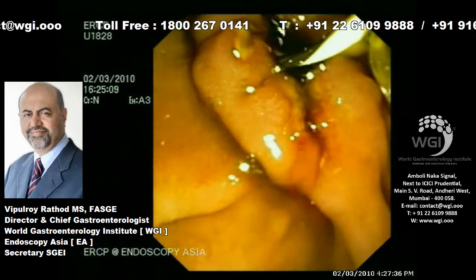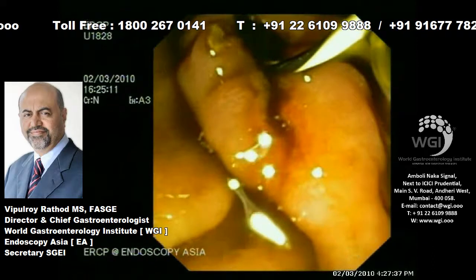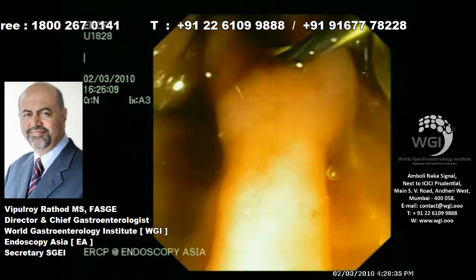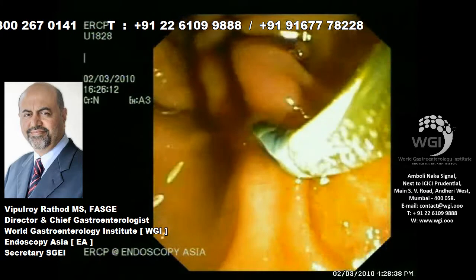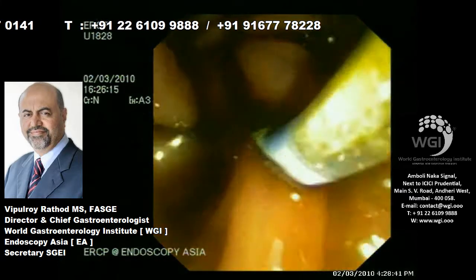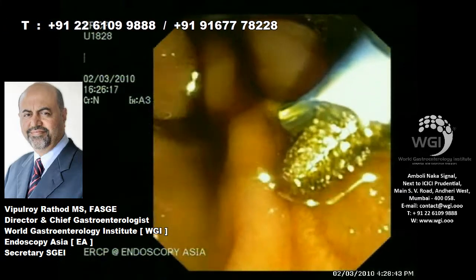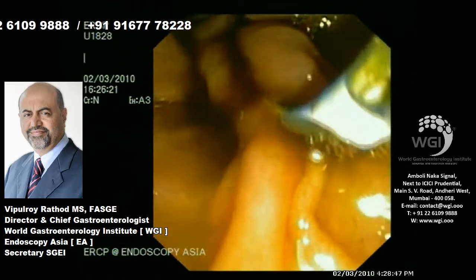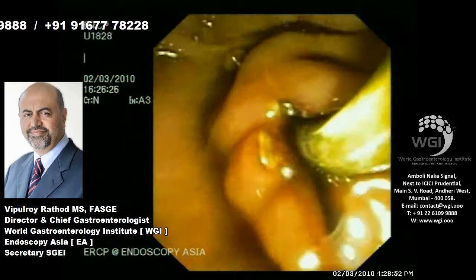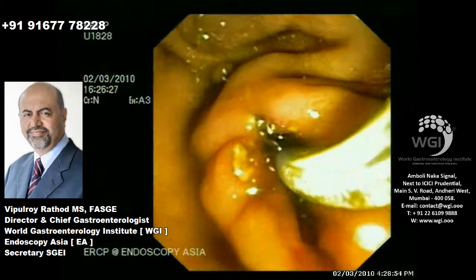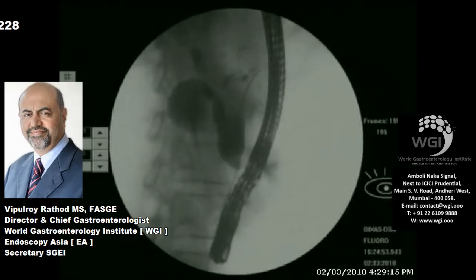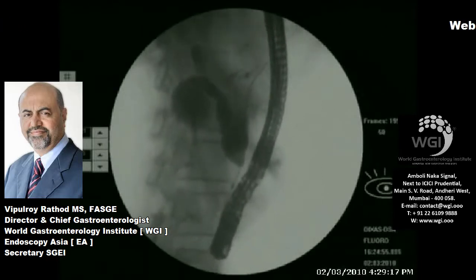It's standard practice at our unit. You can see dark bile draining, and as a routine procedure we are taking brush cytology again from the stricture. We make sure we have adequate material for tissue diagnosis — in almost all cases we do this, so brush cytology will provide additional material.